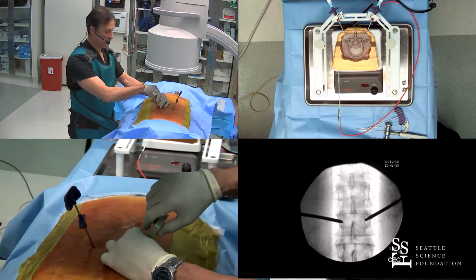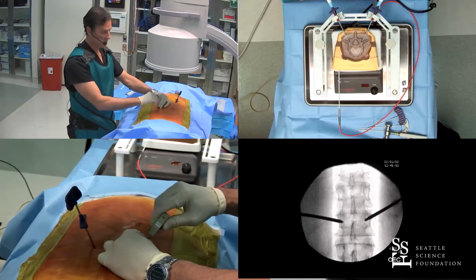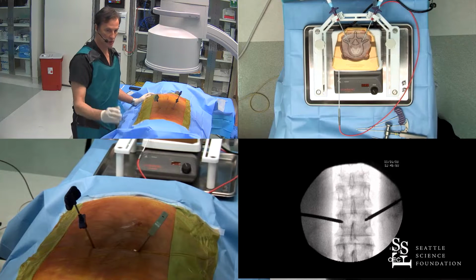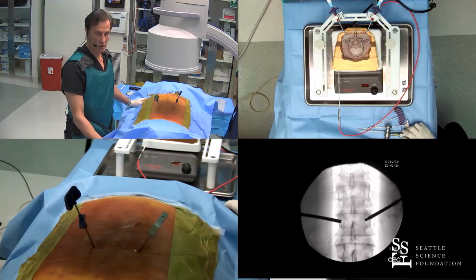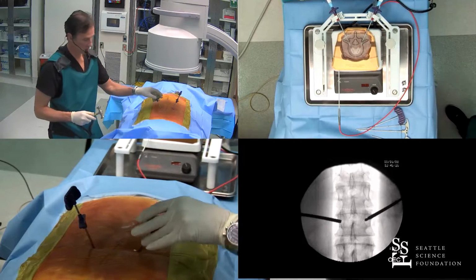And what we can do is we can just turn the direction toward me, the tip, and the bevel alteration of this will give you a few more millimeters. So keep in mind the distal tip of the needle here, and then we'll shoot it after turning the bevel, and it gives you a few more millimeters of access. So we'll go ahead and switch lateral.